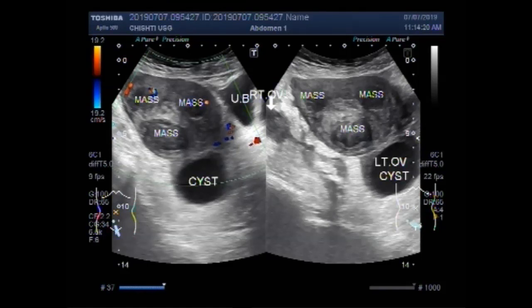Dear viewers, I hope you are all fine. This ultrasound video shows multiple uterine masses and an ovarian cyst.